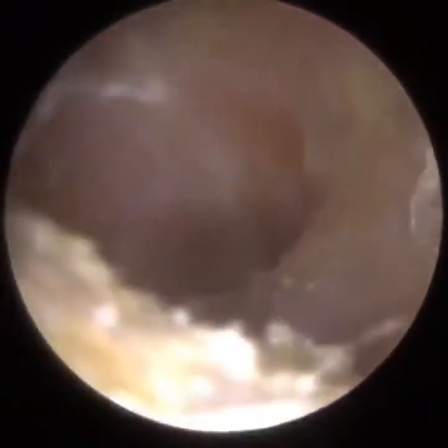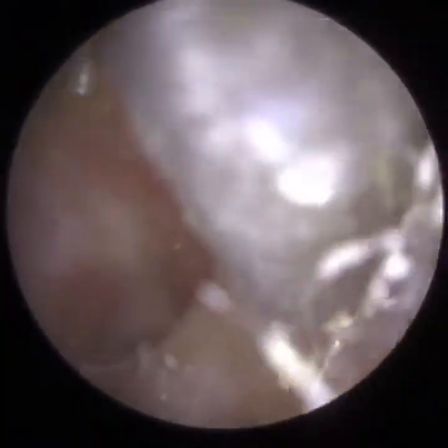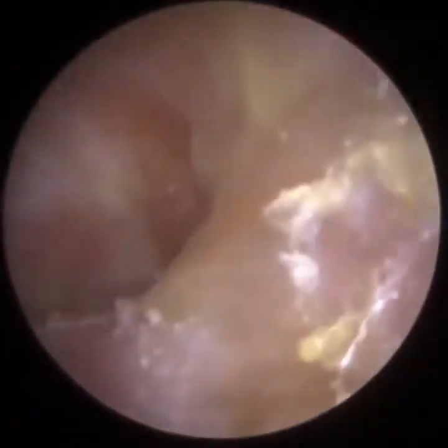So we know sooner or later this skin is either going to get infected or crusted again. So I'm just trying to remove as much as I can. So even if it means the patient having to return in 6 months as opposed to 5 months, it's a month whereby the patient is symptom free.